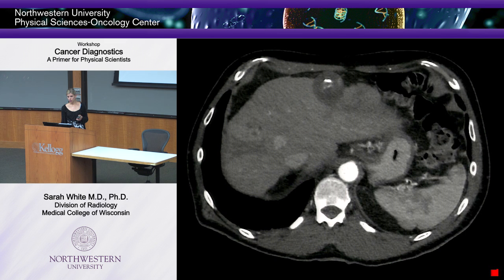And here we are today. Okay, I just saw him in clinic, I think 2 weeks ago, and this is what a scan looked like. How's it look? The same, right? Does anyone see any enhancement? This is a lipiodol, and I'll tell you this is also a lipiodol. So we do a non-contrast image, then we do the arterial phase, and we see, is there any enhancement? And there wasn't. It looked exactly the same on both.